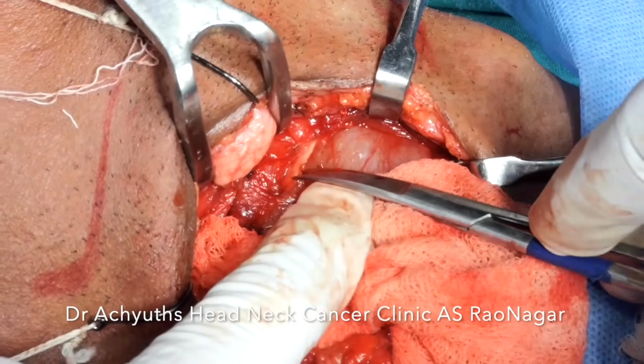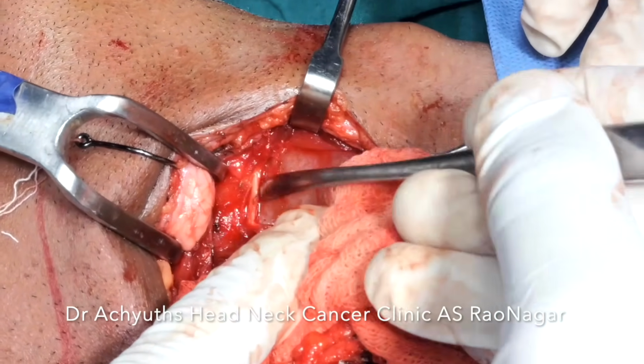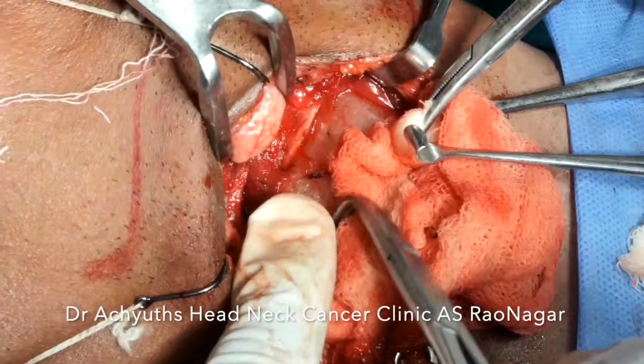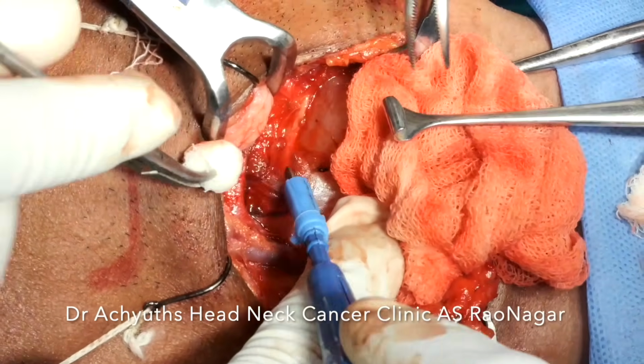And whenever we are just hugging the bone, we don't usually injure those structures. We don't have to worry so much about those structures now. Just keep dividing from the inferior part.